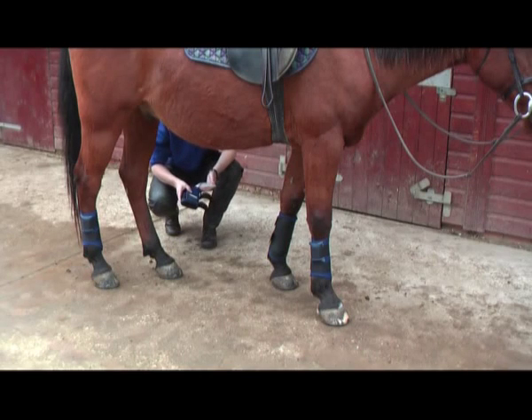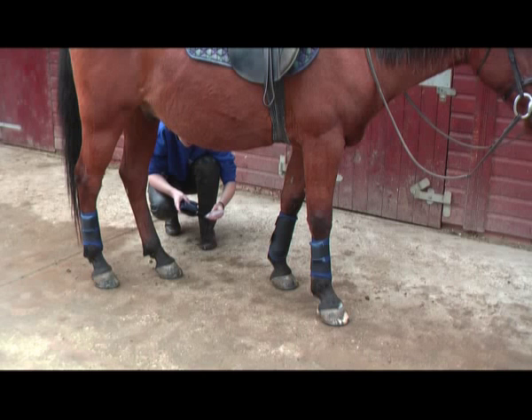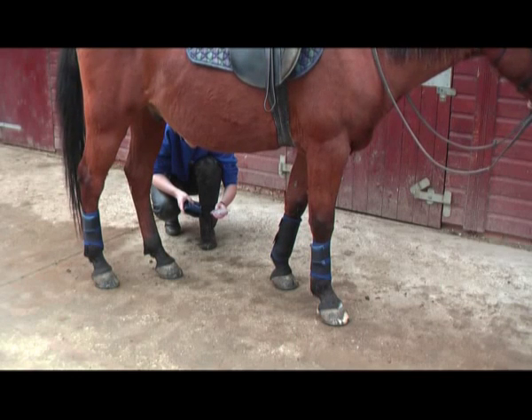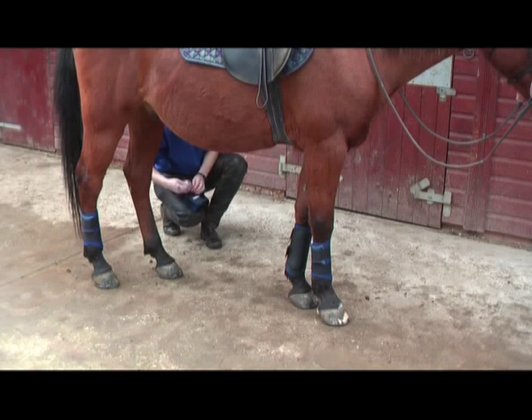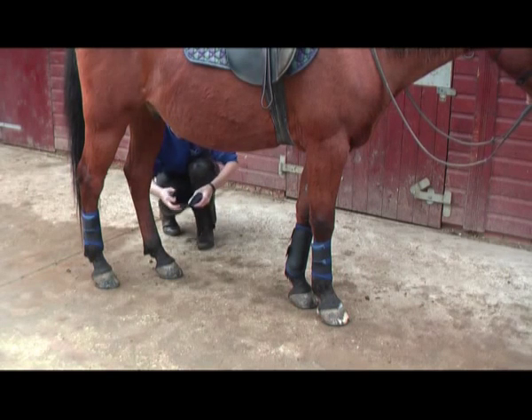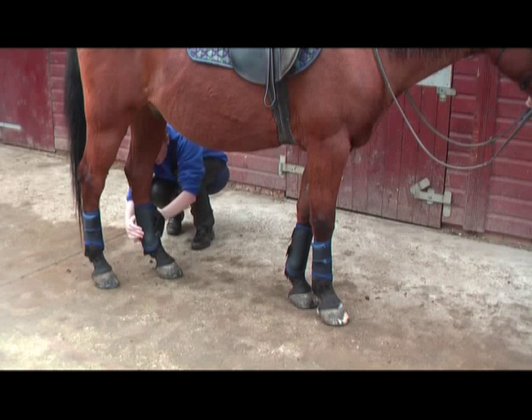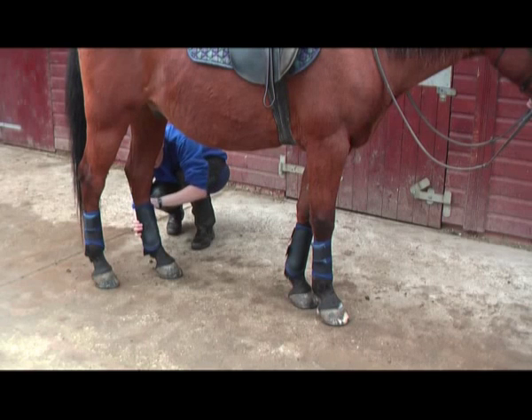And the last leg — the sensor says it's the left hind. I don't see any lights present on the sensor. I switch on the sensor with its little black button. I now see a green flashing light, which means it's collecting data. I put it into my little pocket and secure my boot via the bottom strap first and then the top strap over the sensor in its pouch.